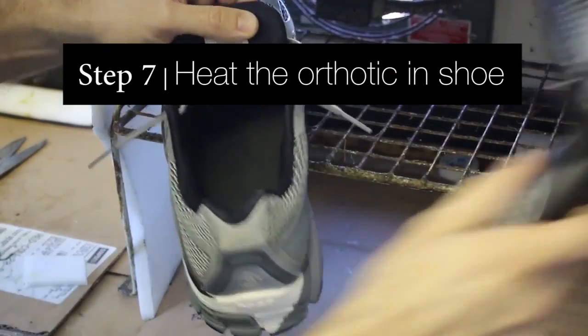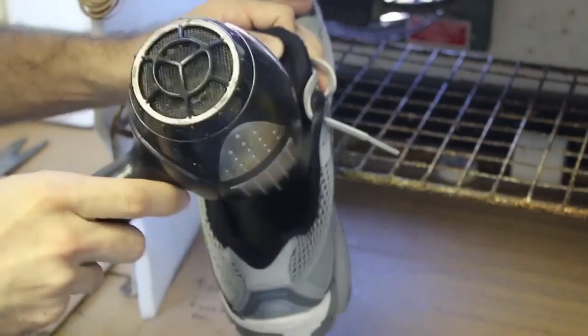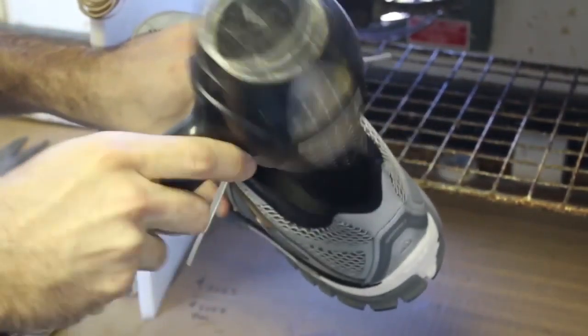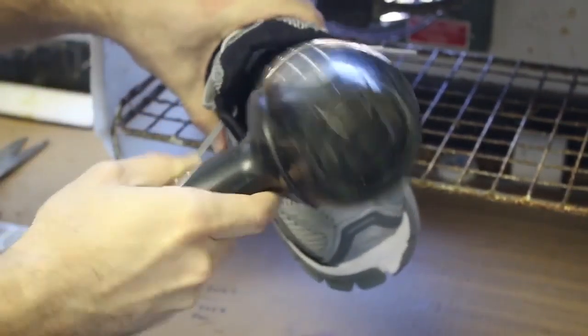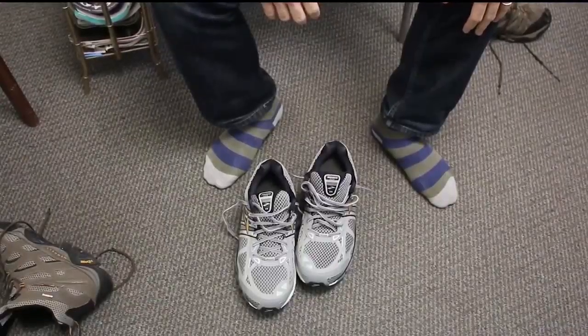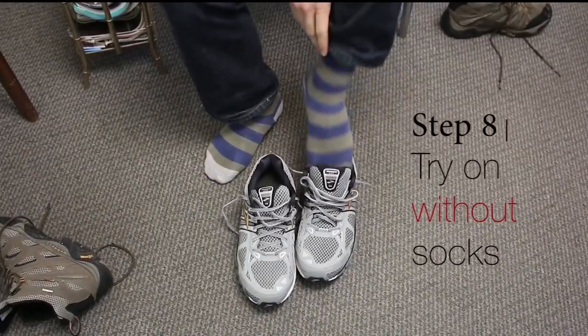Step 7. Heat for 10 seconds. Once properly seated in the shoe, heat the orthoses using a hairdryer for 10 to 20 seconds. High temperature heat guns are not recommended and may compromise the integrity of the material. Do not allow the heat to concentrate on any one area of the orthotic. Keep the heating element in motion. Heat is used to lightly soften the material and facilitate the molding of the orthosis to the foot.